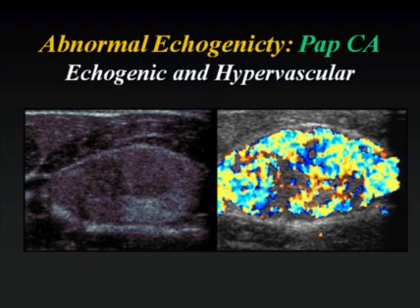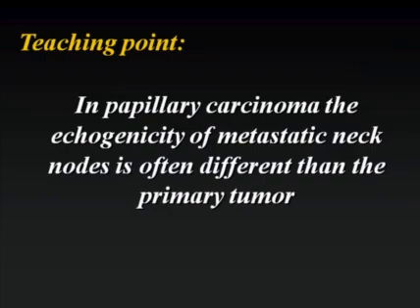Actually, the thyroid gland was completely normal in this individual, and a thyroidectomy had only a 2 millimeter carcinoma, yet presented with a neck node. See how strikingly echogenic it is and how strikingly vascular this is. We'll make the point when we talk about biopsying highly vascular lymph nodes that we have to use a capillary technique rather than a suction technique, or we'll just get blood.